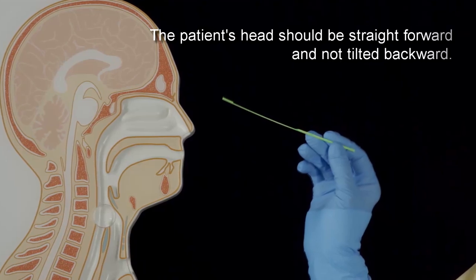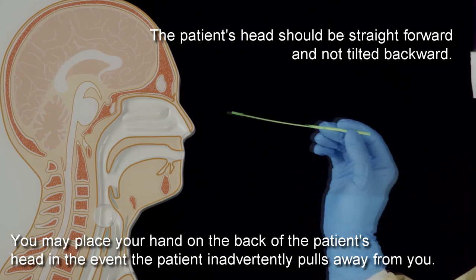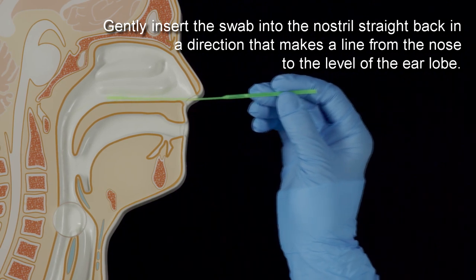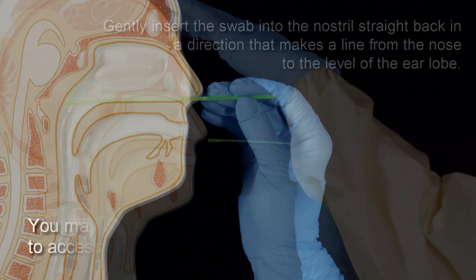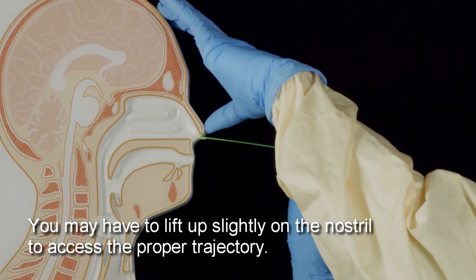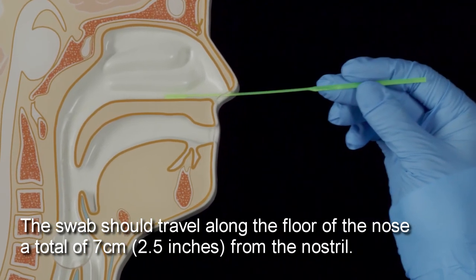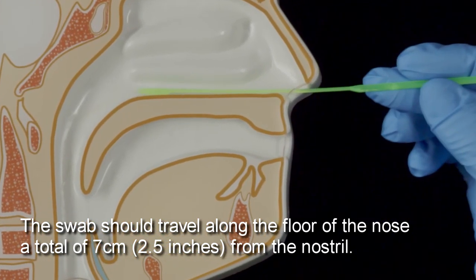The patient's head should be straight forward and not tilted back. You may place your hand on the back of the patient's head in the event that the patient inadvertently pulls away from you. Gently insert the swab into the nostril straight back in a direction that makes a line from the nose to the level of the earlobe. You may have to lift up slightly on the nostril to access the proper trajectory. Avoid going up and there should not be any bending of the swab. The swab should travel along the floor of the nose a total of seven centimeters, or two and a half inches, from the nostril.